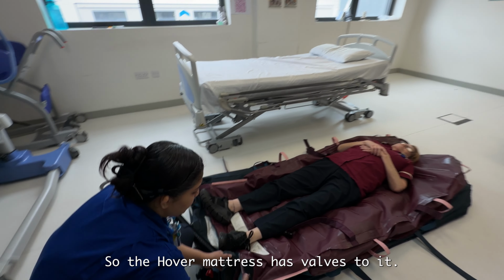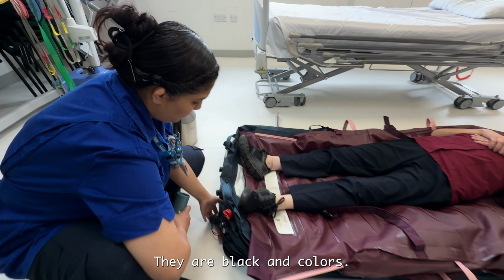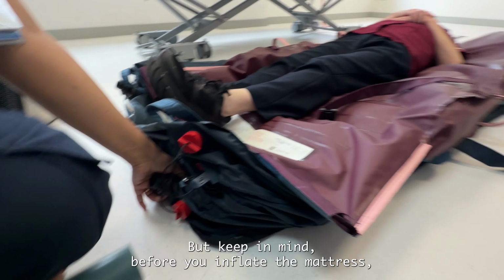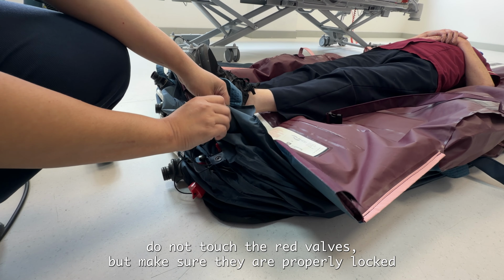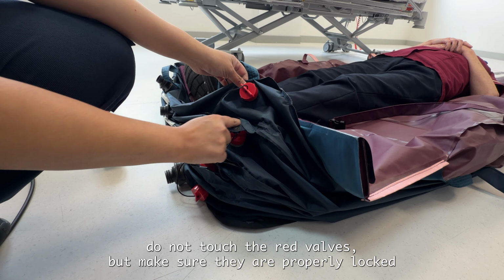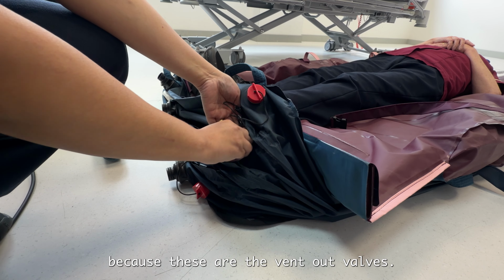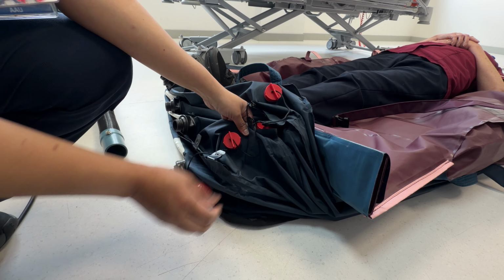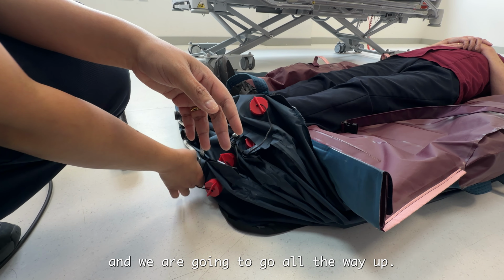So the hover mattress has valves to it. They are black in color, but keep in mind before you inflate the mattress, do not touch the red valves, but make sure they are properly locked because these are the vent out valves. And then we are going to start from the bottom valve and we are going to go all the way up.